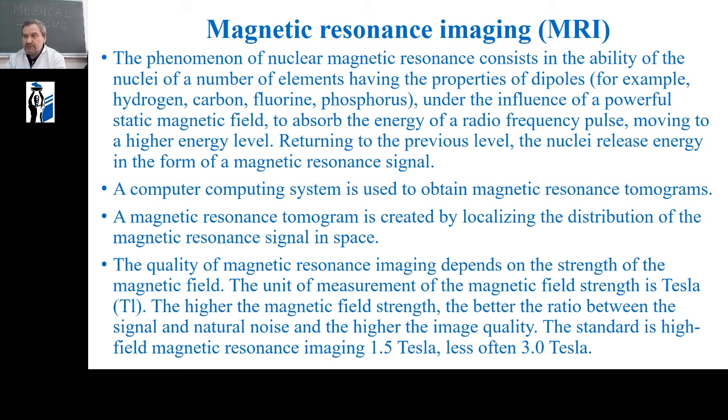Returning to the previous level, the nuclei release energy in the form of a magnetic resonance signal.